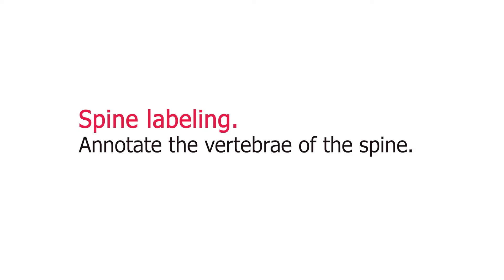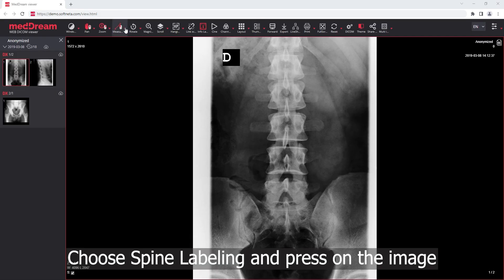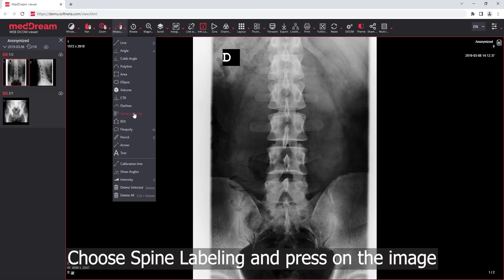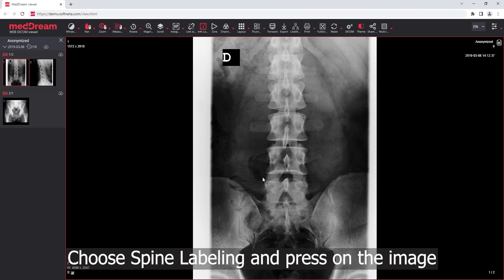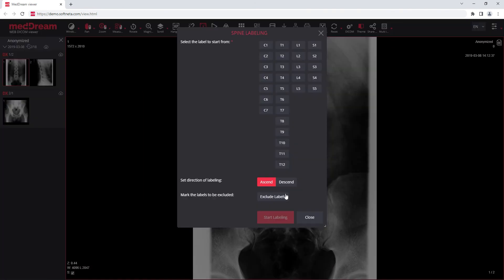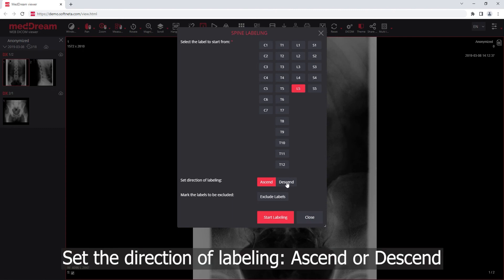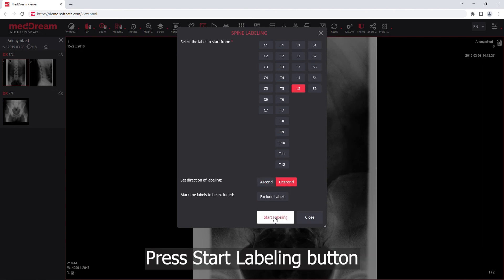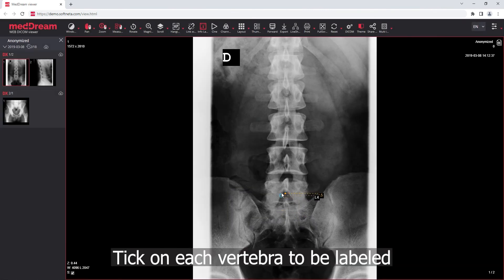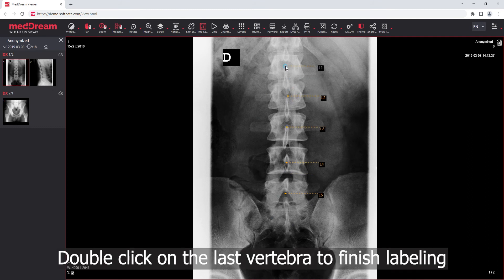Spine Labeling: annotate the vertebrae of the spine. Choose Spine Labeling and press on the image. Select the vertebrae from which to start labeling and set the direction of labeling. Press the Start Labeling button. The first vertebra is labeled. Click on each vertebra you need labeled, then double-click on the last vertebra to finish labeling.